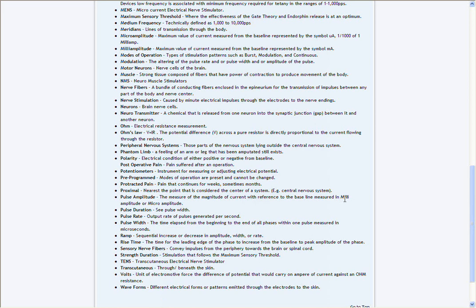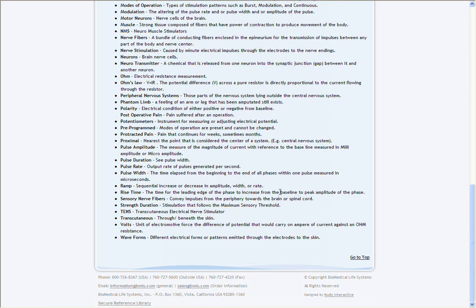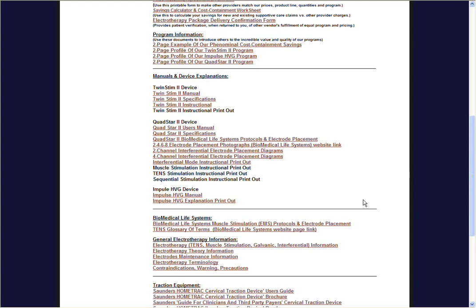So you can go really strong. If you say you have body fat, you're trying to get through to get to the muscle, you might have to turn the amplitude up really a lot stronger. It depends on the size of the muscle and yourself. Pulse width, the time elapsed from the beginning to the end of all phases within one pulse measured in microseconds. Ramp, the sequential increase or decrease in amplitude, width, or rate. So there's this terminology for you to use, to look at and review.